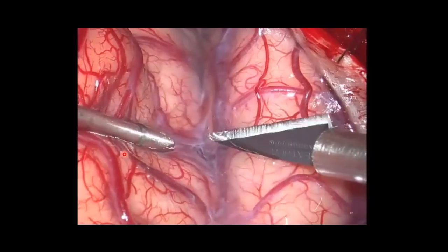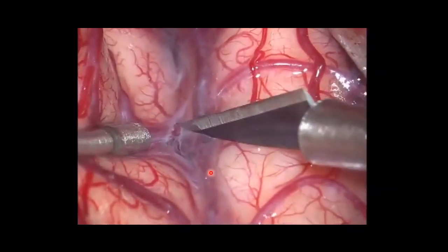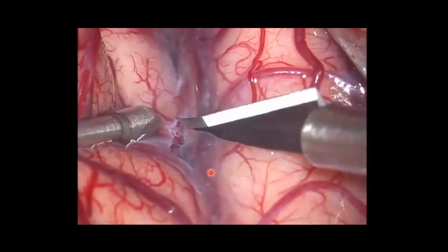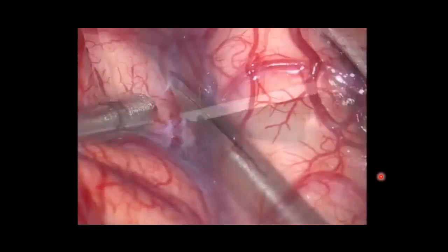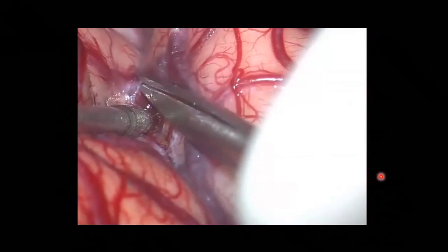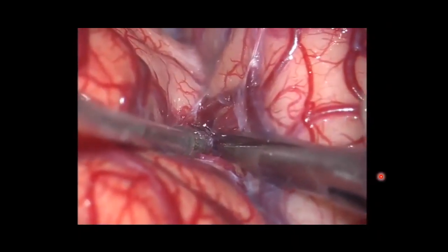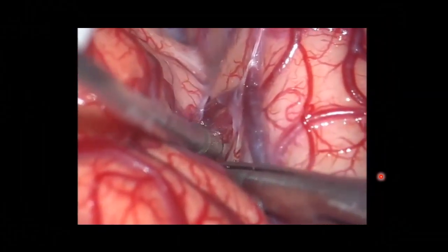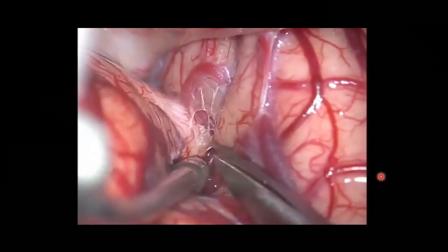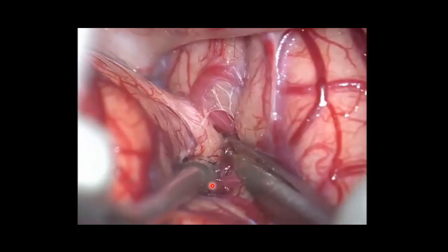So this is the right frontal lobe, right temporal lobe. He's dissecting the superficial part of the sylvian fissure using sharp dissection, mainly knife and scissors. Now gently, slowly. We've seen this many times during this chapter. So cutting the arachnoid, retracting with the suction tube.